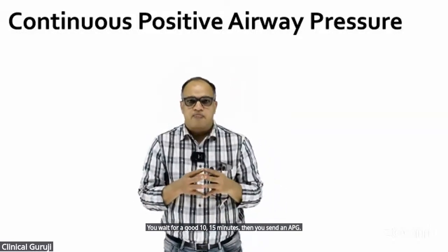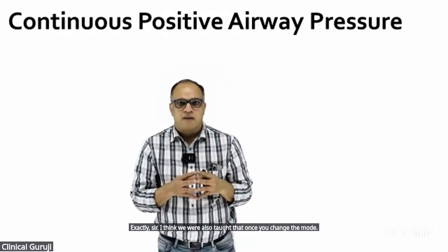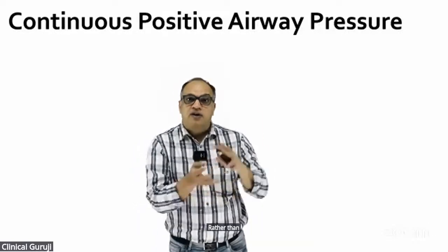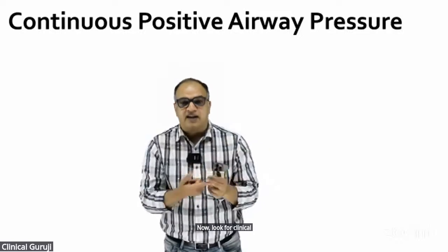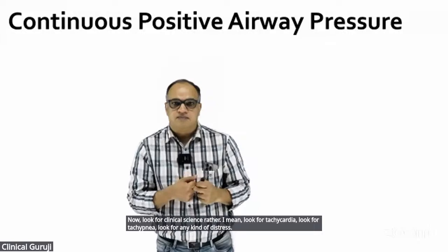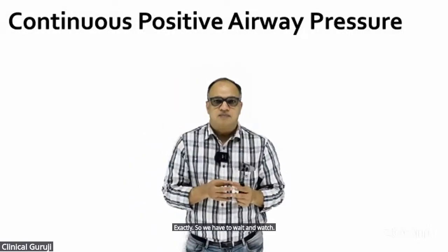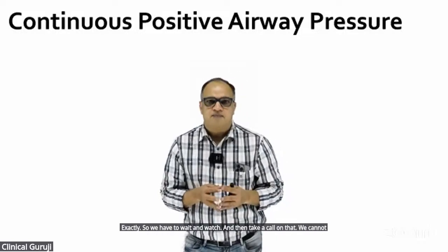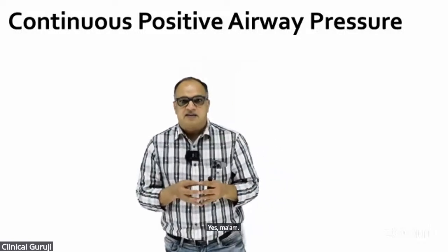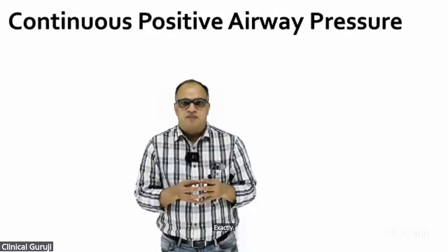Exactly, sir. I think we were also taught that once you change the mode, you have to wait and watch the patient rather than go off for a cup of coffee. Look for clinical signs: tachycardia, tachypnea, any kind of distress. We have to wait and watch and then take a call. We cannot just walk away after changing the mode, because the body will take some time to adjust to the new mode. Exactly.